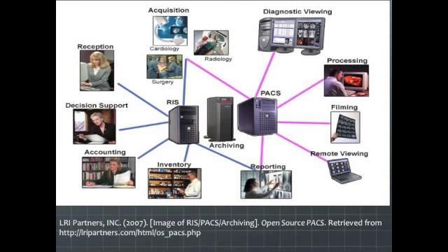The images are actually more detailed with the invention of CR and DR, computer radiography, now digital radiography. You see a whole lot more than you ever could with film. So the benefits are just huge. You can get reports back to the doctor a lot quicker because, like I said, you have radiologists that, I've worked at some places in the past where at nighttime the radiologists are working at home. The monitors are a lot more expensive because they're looking at so much detail.